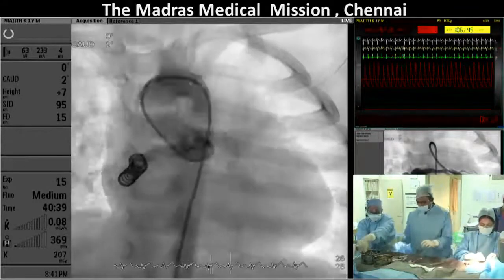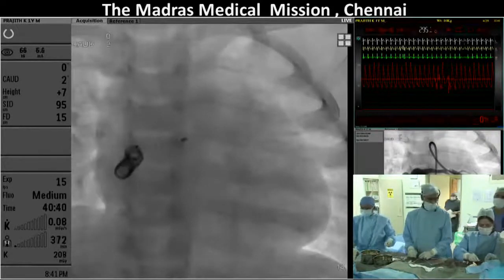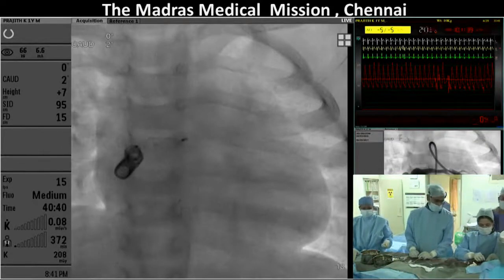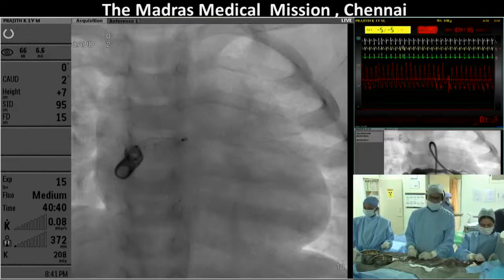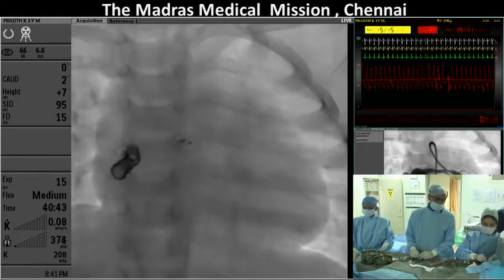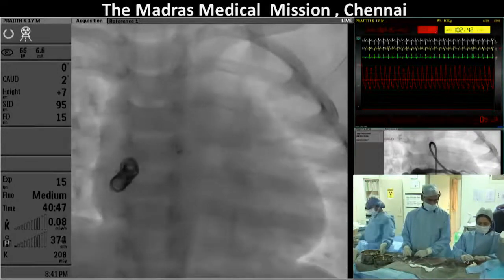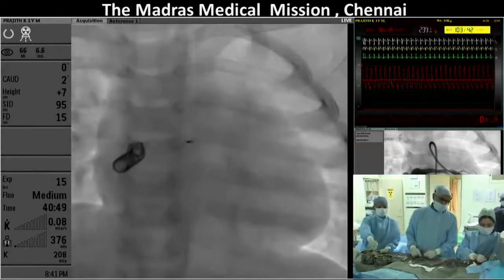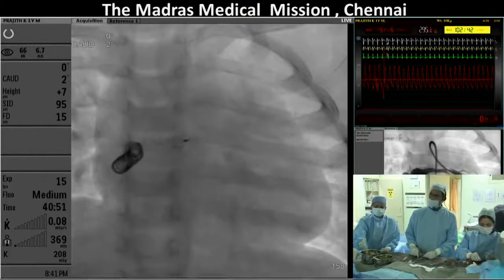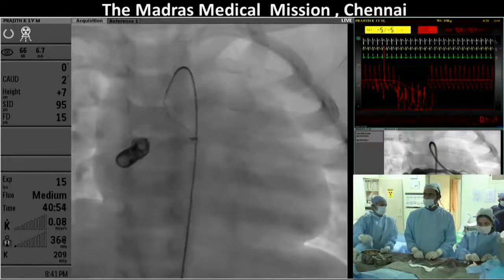It's especially useful if the course to the right side, or to the distal part of the fistula, is highly serpentine, with very convoluted course between the aorta and the right atrium. Get as far out as you can and drop a 5 millimeter coil. It won't go to the pulmonary arteries, and it won't occlude a coronary artery.